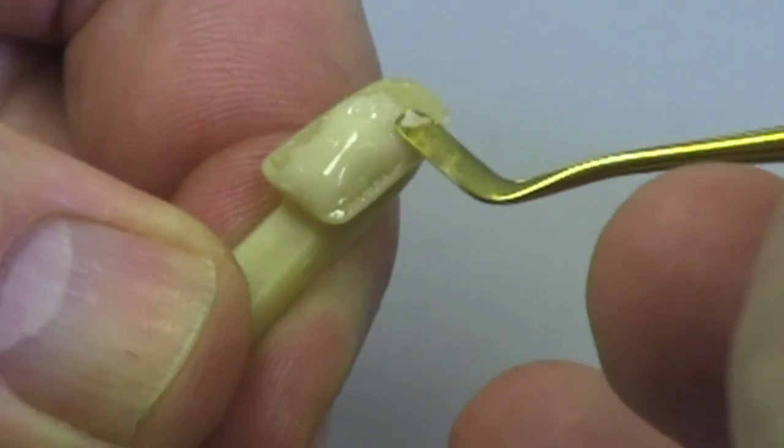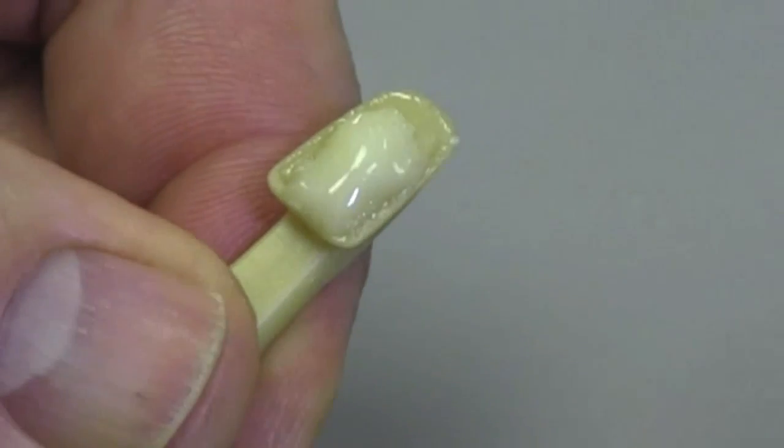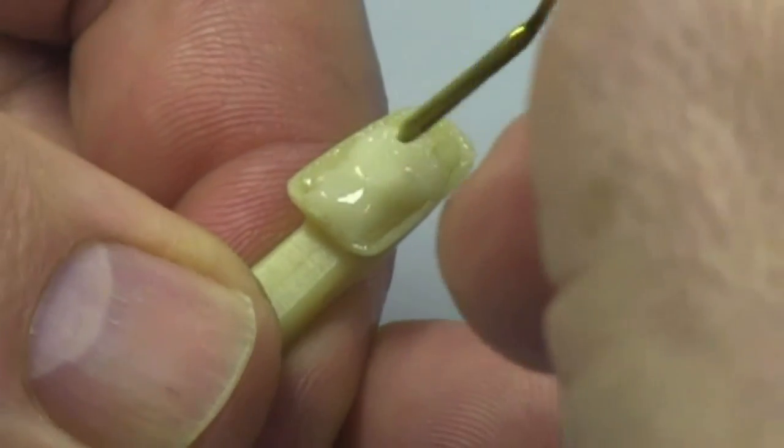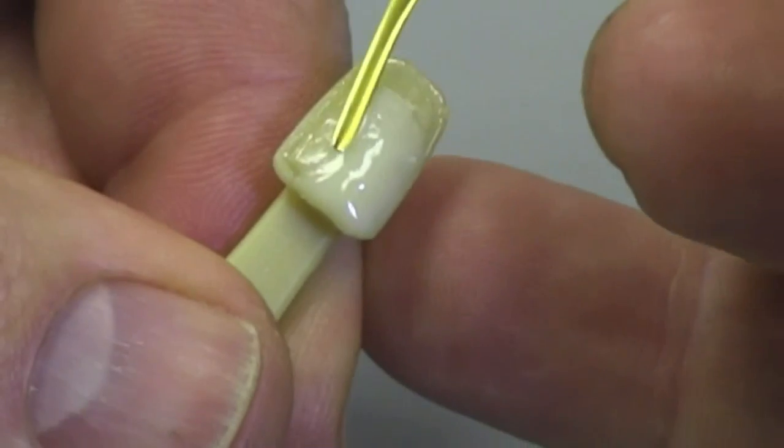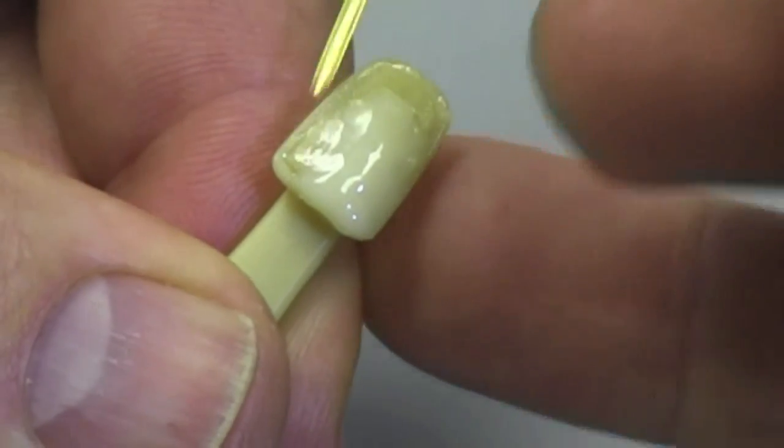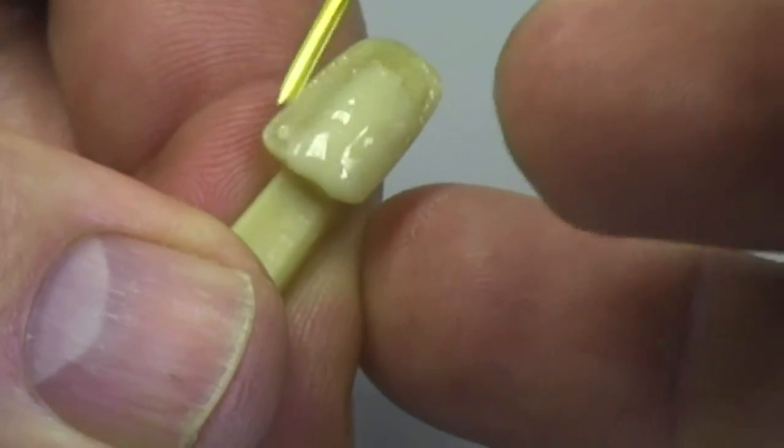Once I start to place that material in the proper area where I'm blending it in, then I can switch over to a finer instrument. This is my favorite instrument that I use predominantly, and it's the IPCL, or Interproximal Carver Long.